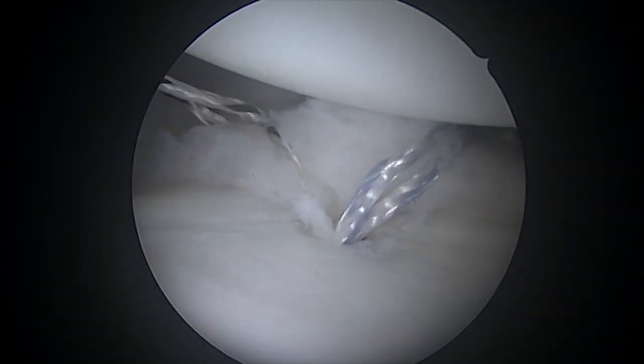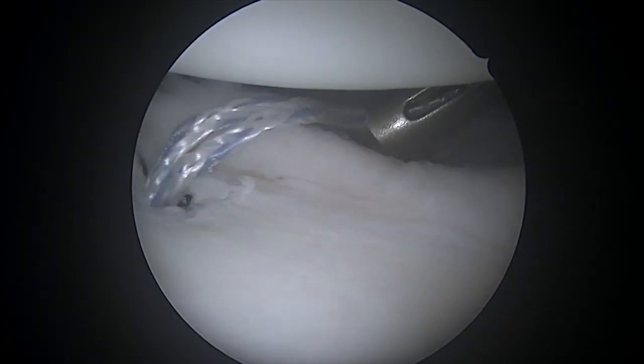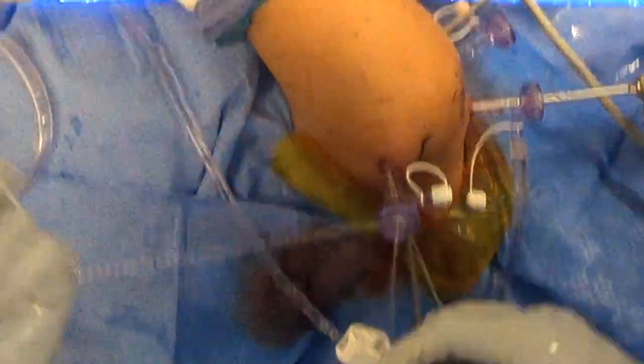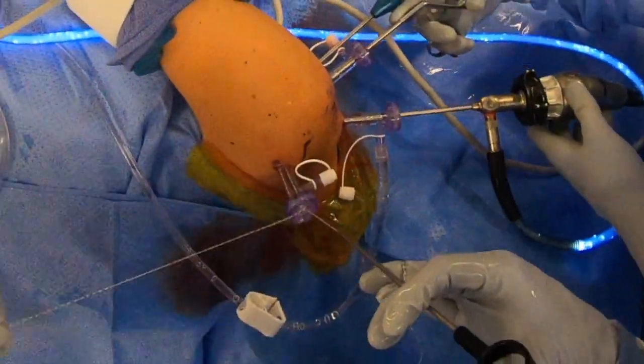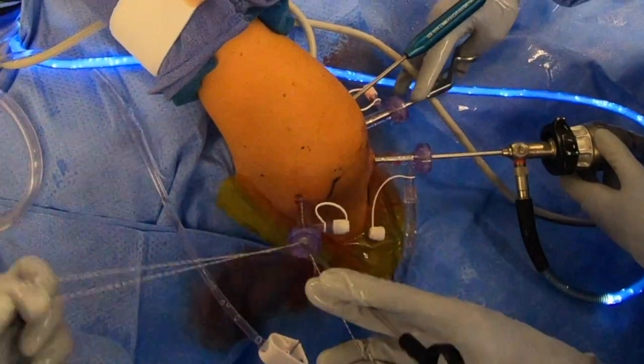You'll see that as I bring this up, it creates this beautiful bumper of tissue that helps to stabilize the shoulder. I also use all double-loaded anchors here, and the benefit is you get more points of fixation in the capsule, more tightening of the capsule for fewer numbers of anchors. That's a real benefit in a procedure like this, where the whole idea is to get more fixation and more tightening of the capsule.